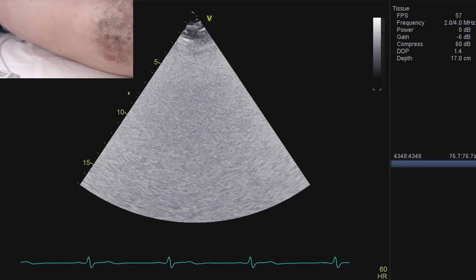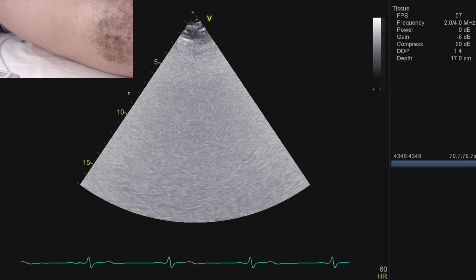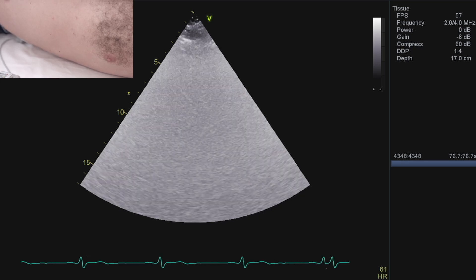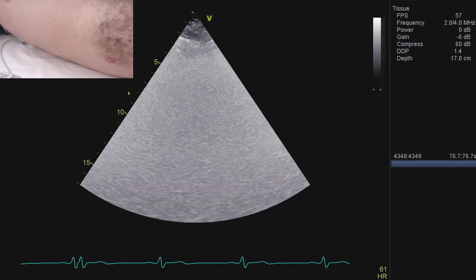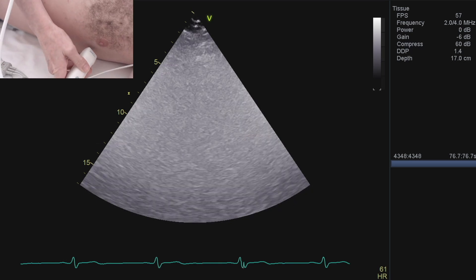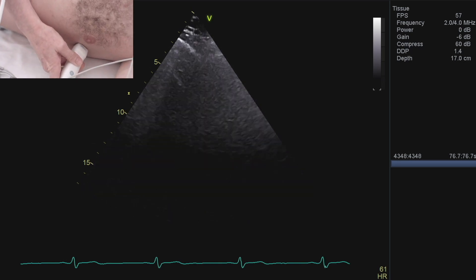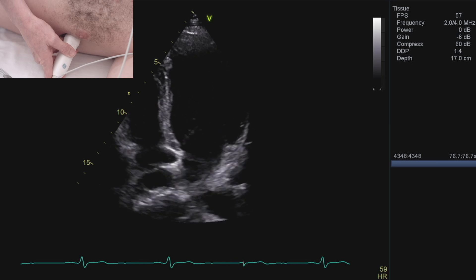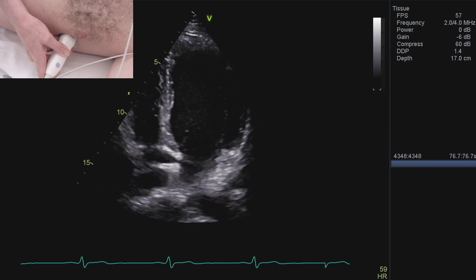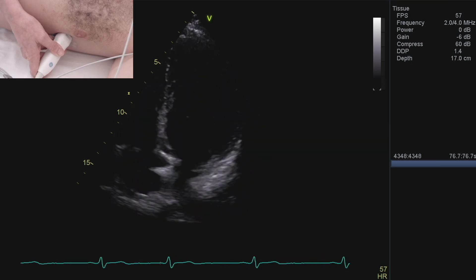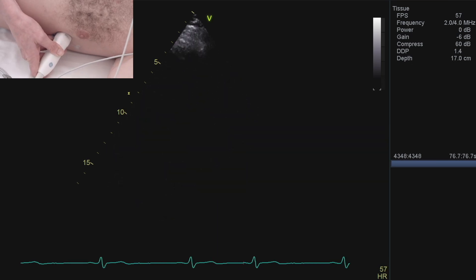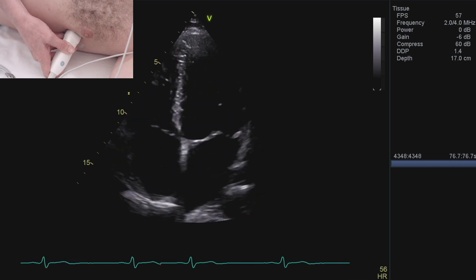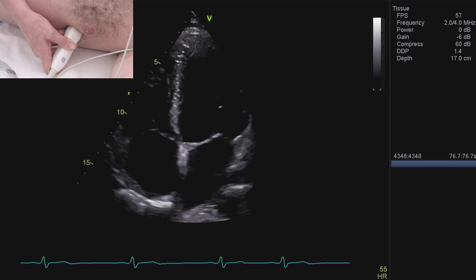Now we're going to move on to a completely different echo window — the apical window, to get a series of apical views. This means putting the probe on the apex beat, with the notch angled towards the left shoulder. The trick is to get the view as well as you can, as far down the chest as possible, so you're not foreshortening.